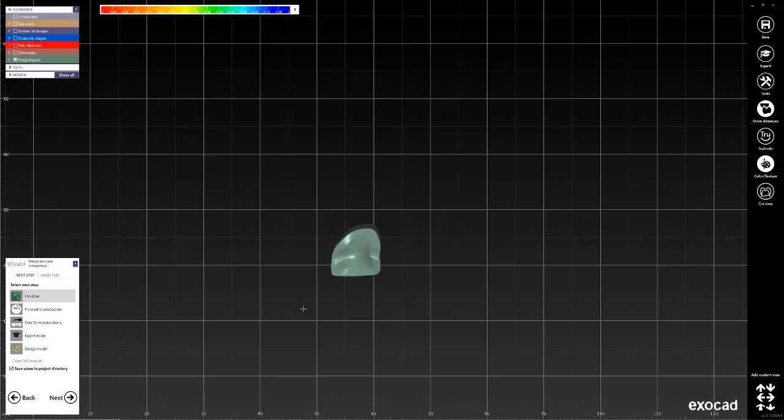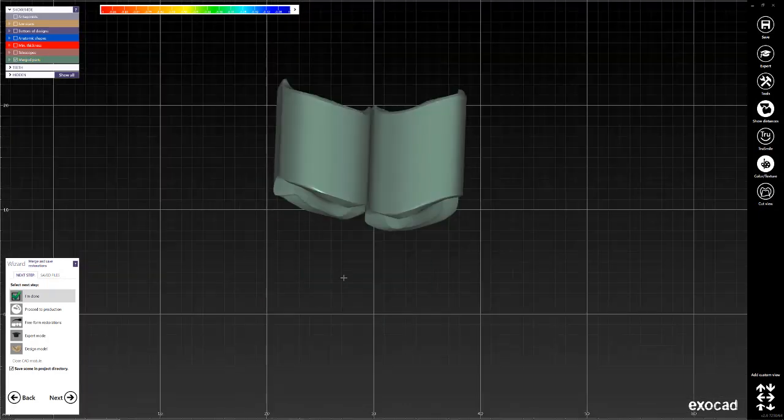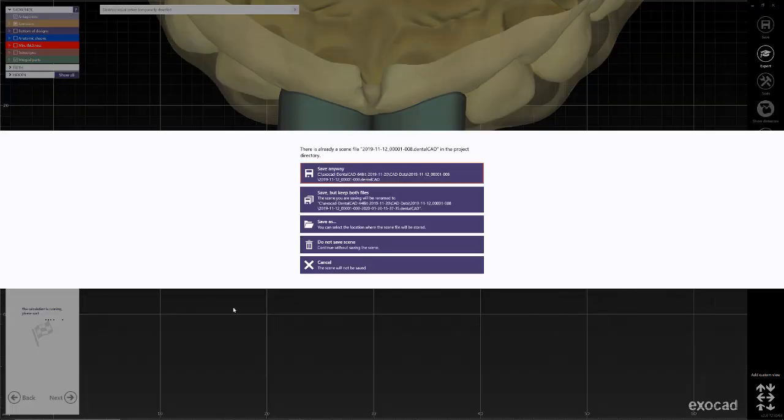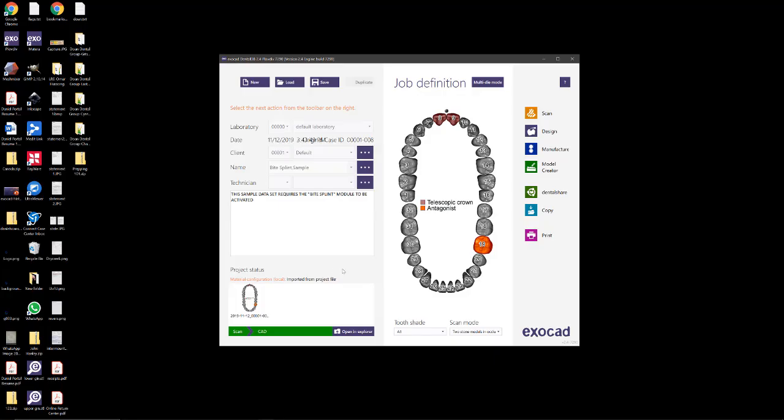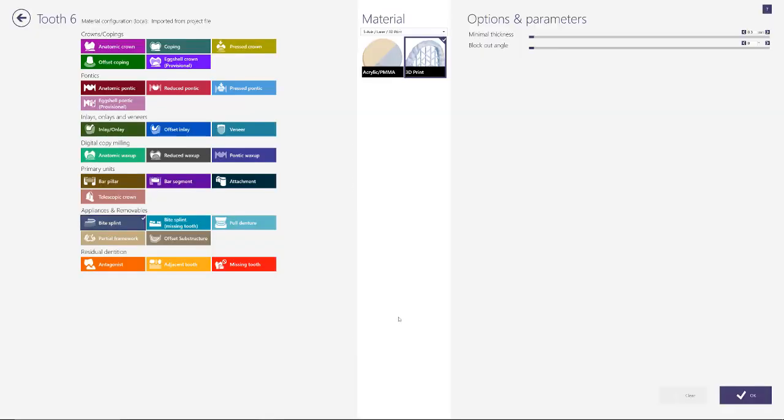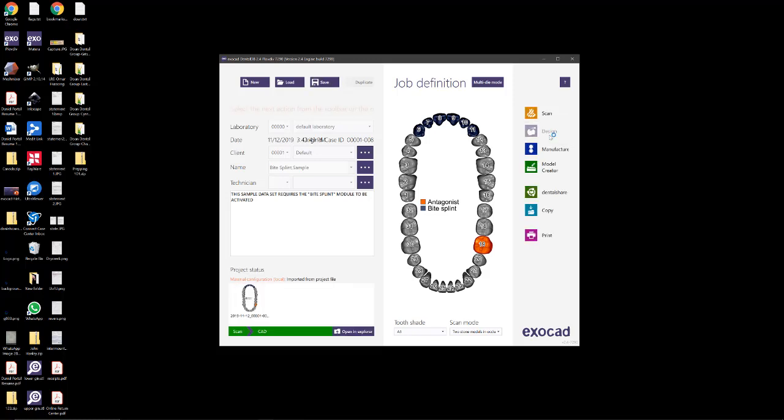The reason why we're saving this instead of using the STLs that are produced is that sometimes when the STLs are produced they lose their position in space, so we want to make sure to keep that. Once we're done with that, we can click I'm done, we don't need to save anything, and then we're going to create our order form which is going to be a bite splint. Doesn't matter what manufacturing material or process you select here, you just want to create the splint. We'll click save and go into the design immediately.